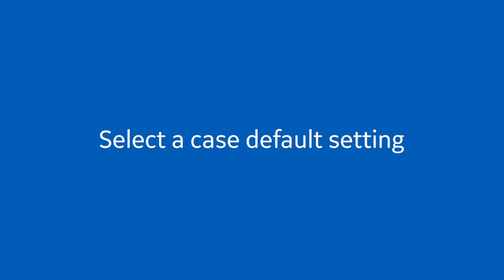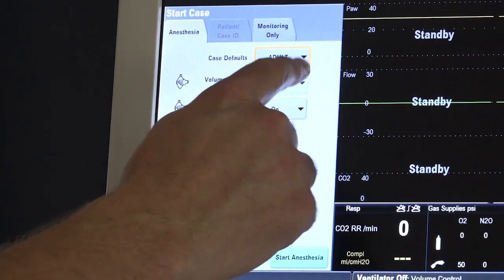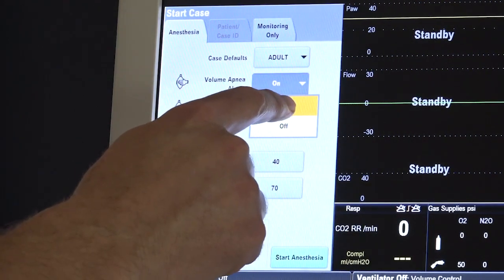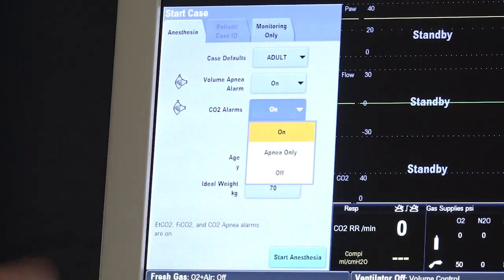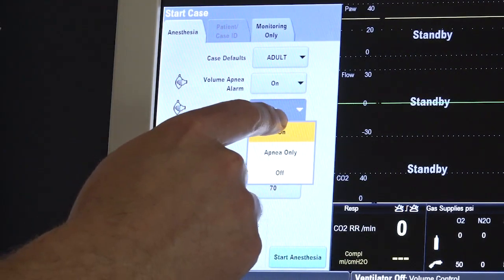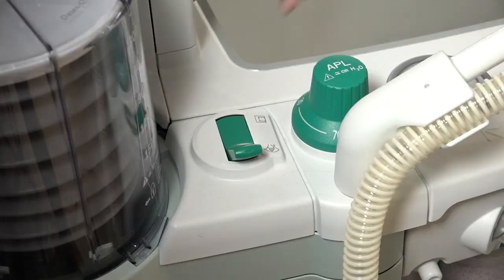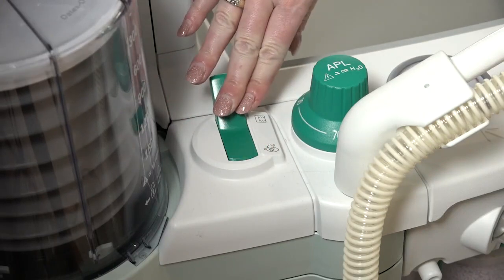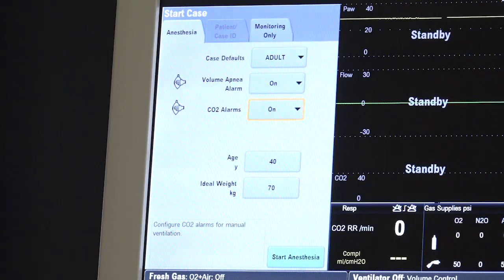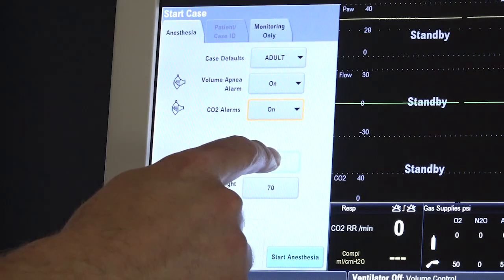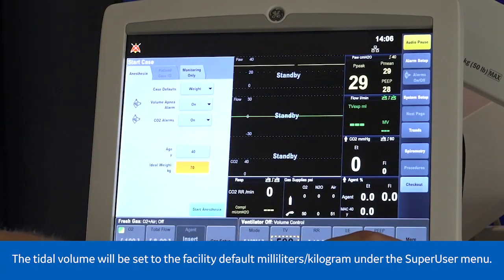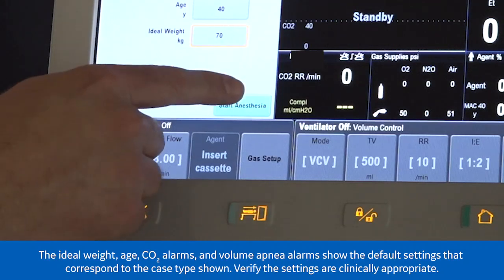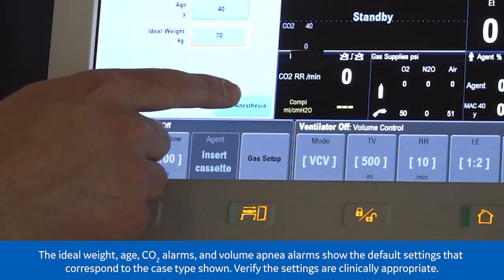To select a case default, select a case type from the menu. The volume apnea and CO2 alarms can be left on or turned off. If the volume apnea and CO2 alarms are turned off, they will turn back on once the bag to vent switch is moved to ventilation. To enter your patient's age, select age. To enter your patient's weight, select weight. Select start anesthesia and the fresh gas flow starts.